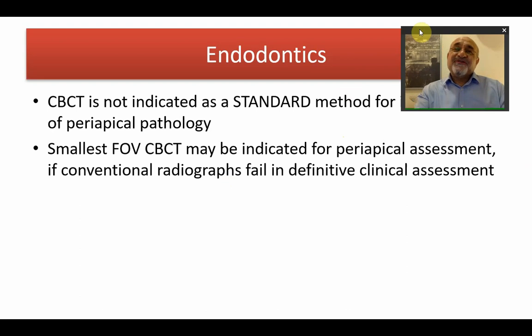Your best choice here is a periapical radiograph, well taken, well done, well exposed. It will give you the periapical lesion coverage. If you feel that this is not enough to show the whole lesion, then you will go for the OPG. You will sacrifice some of the resolution.